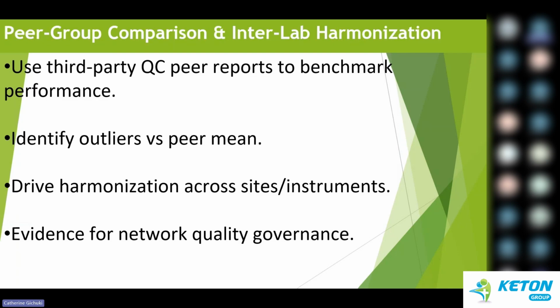So peer group comparison helps ensure every result is not just internally consistent. That is what I can say: that when we do peer group comparison, we are ensuring that it is not just internally consistent, but it is also aligned to our peers, to other labs.